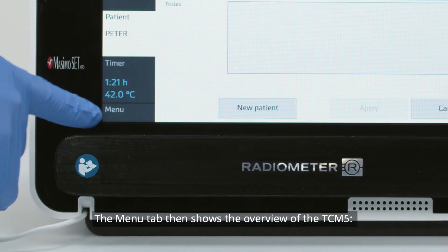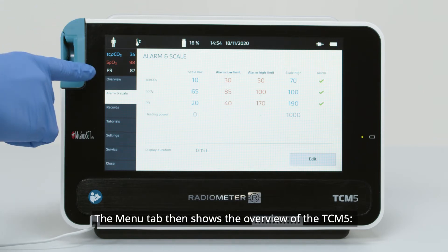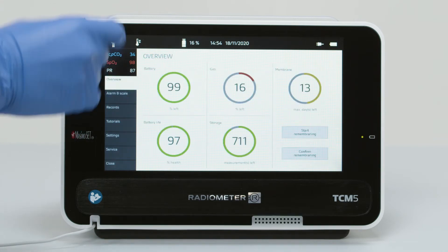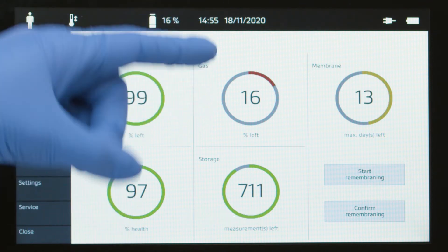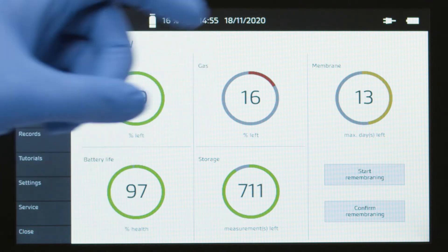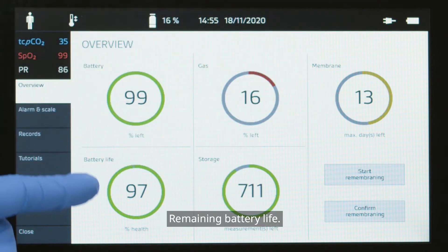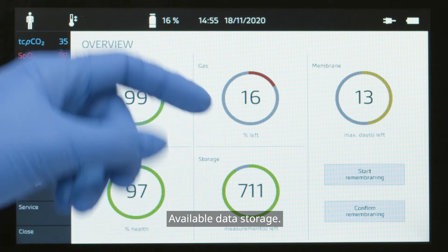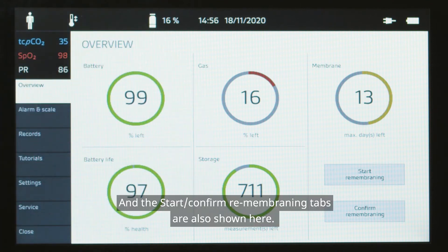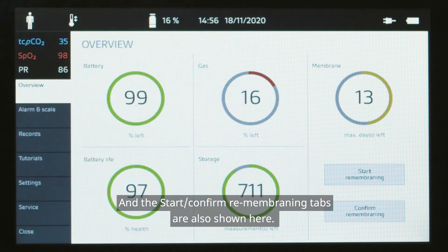The Menu tab shows the overview of the TCM5, including Battery Charge, Gas Level, Remaining Membrane Life, Remaining Battery Life, Available Data Storage, and the Start Confirm Rembraning tabs.